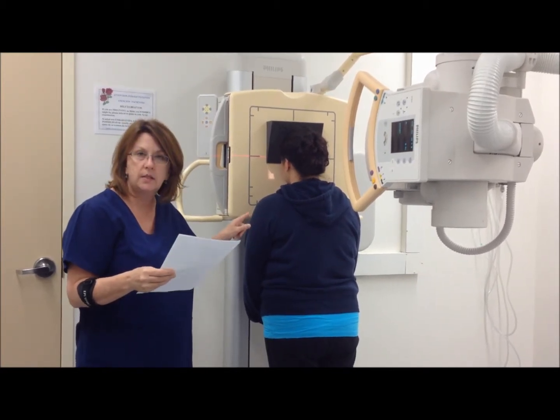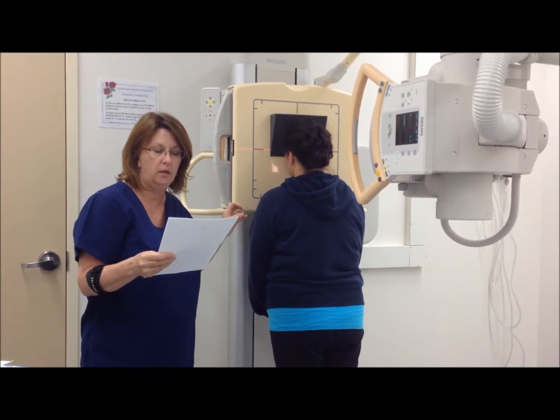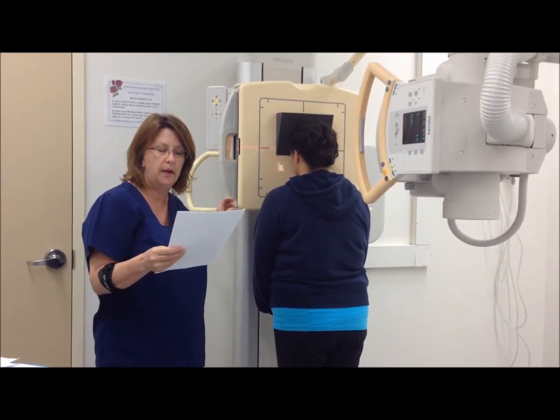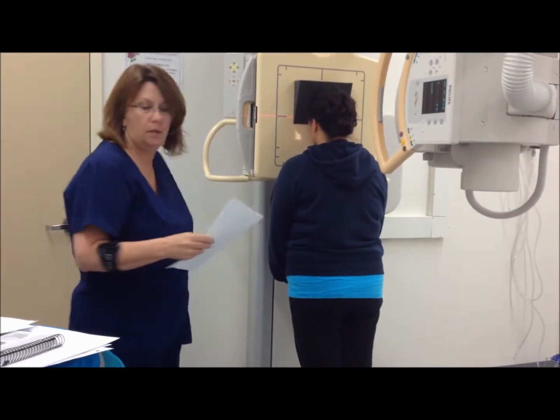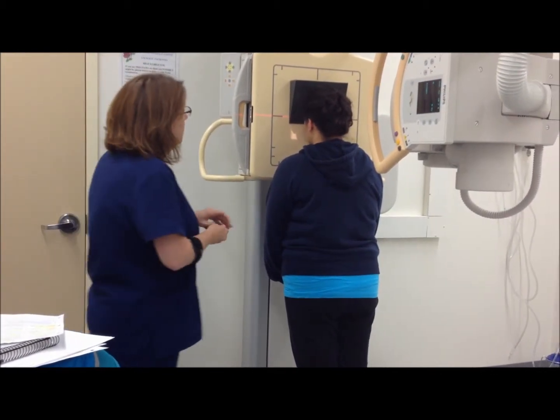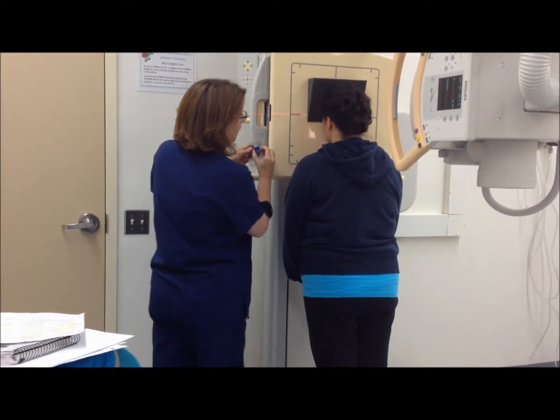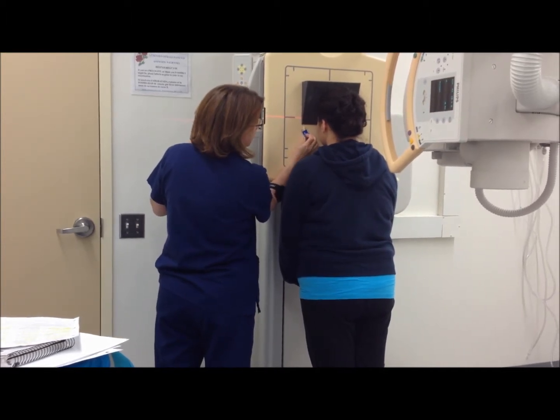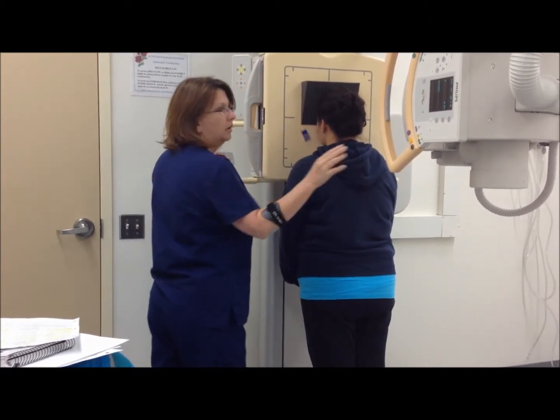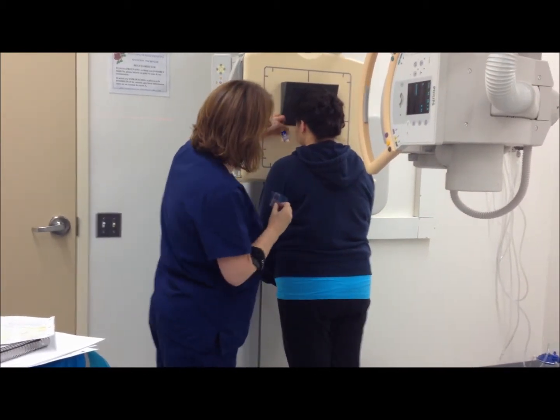My technique for this exam is going to be a kVp of 70 to 75 and my mAs will be 10 to 12 mAs. And my marker, I will be placing the left marker just in the shot. Okay.